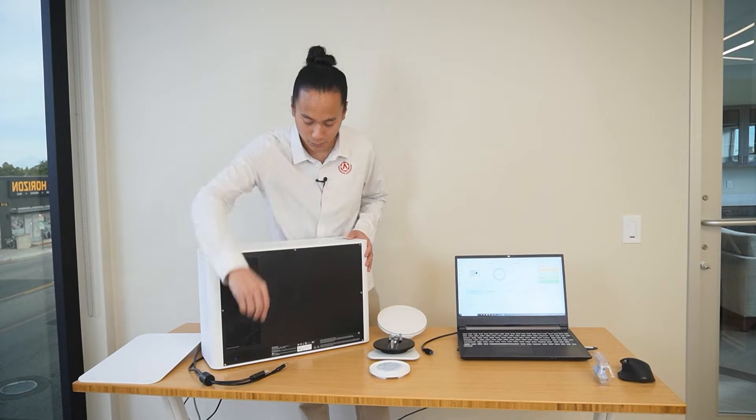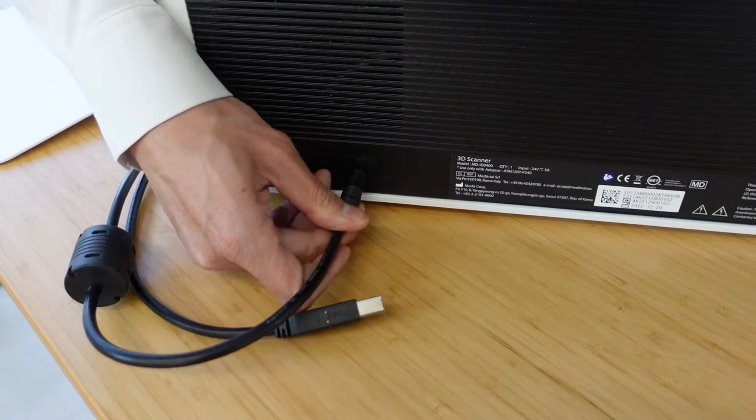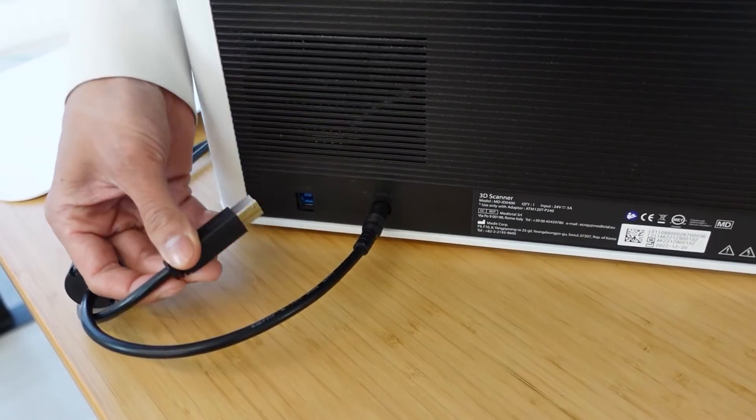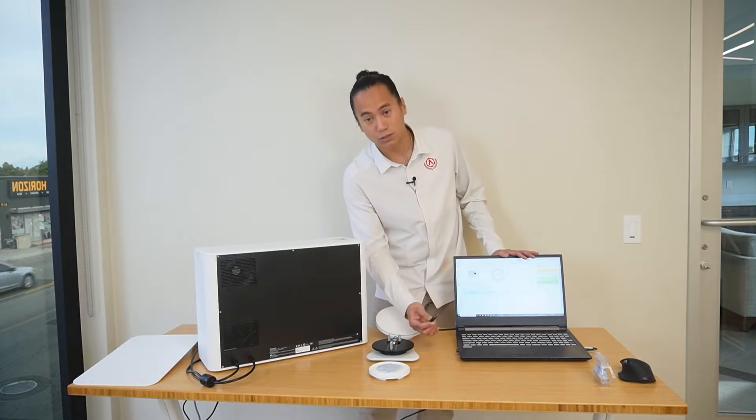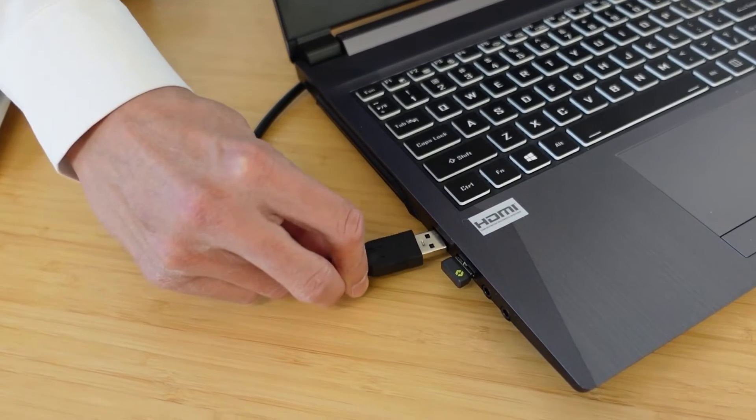We have two cables. We have your power cable that gets plugged in, and then we have your camera connection cable. Now, it's important when you're connecting your scanner to the computer that the camera connection cable gets plugged into a USB 3.0 or super speed port.